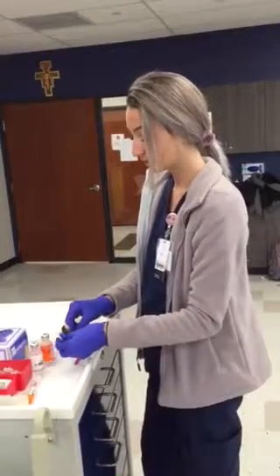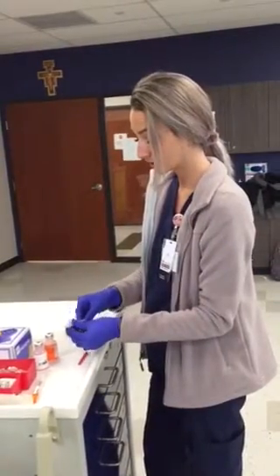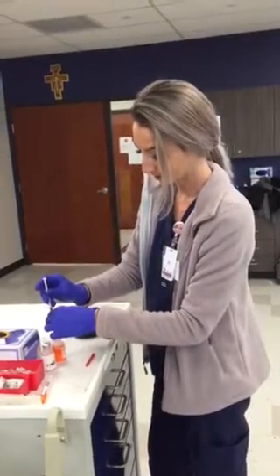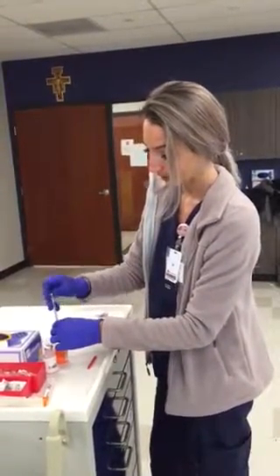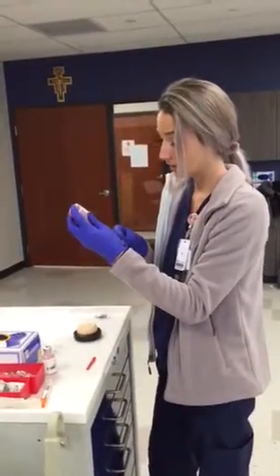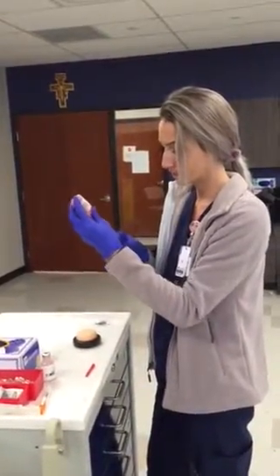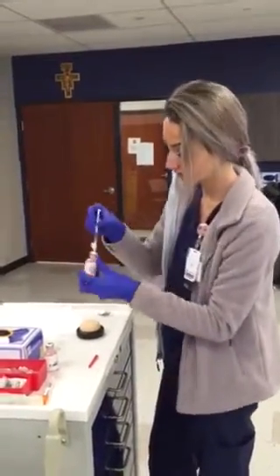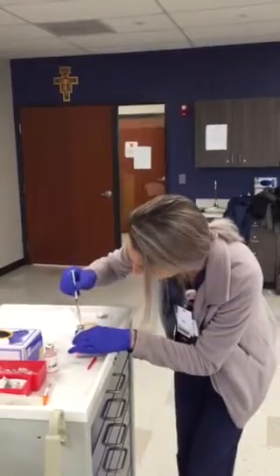I'm gonna attach the needle I'm giving to her and I'm gonna clear this one as well. So she's getting again 1. So I'm clearing this. Now I'm gonna lift it back up to 1, okay, and I'm going to now administer and inject. So I'm taking this to 1, making sure there's no bubbles, making sure I'm eye level.